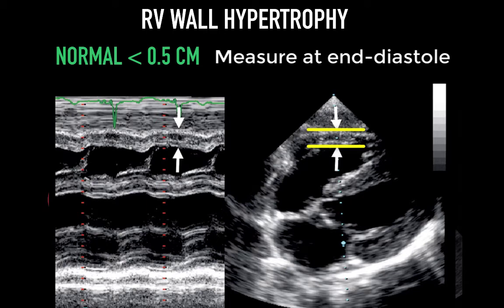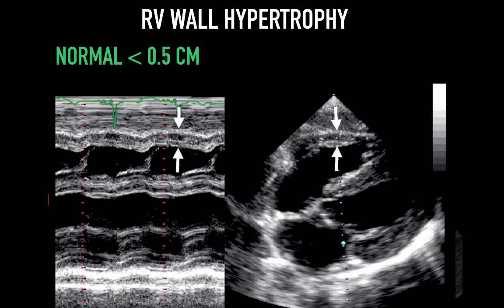You'll need to consider left-sided cardiac function in any assessment of the right heart as well. Again, to measure the thickness, we pass the M-mode beam towards the RV free wall, revealing this M-mode recording. We'll want to exclude any epicardial fat or myocardial trabeculations.